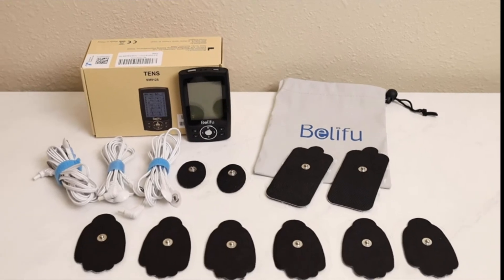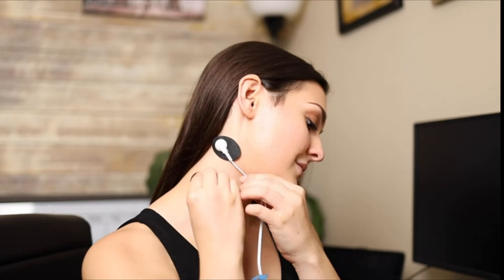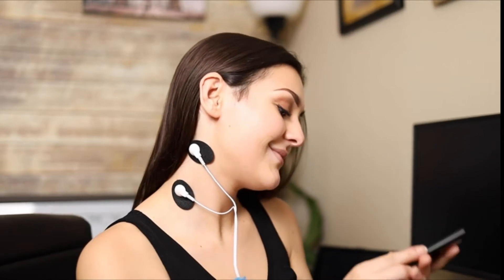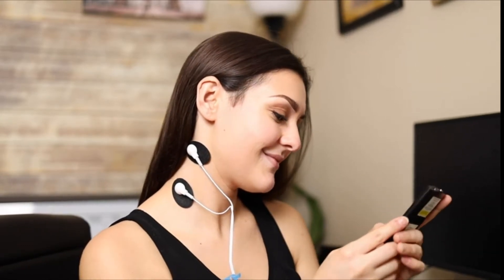The answer is TENS therapy. TENS therapy is an over-the-counter pain relief solution with no side effects, addictions, or health complications. Belifu TENS is equipped with 24 pre-programmed massage modes designed for pain relief and body relaxation.